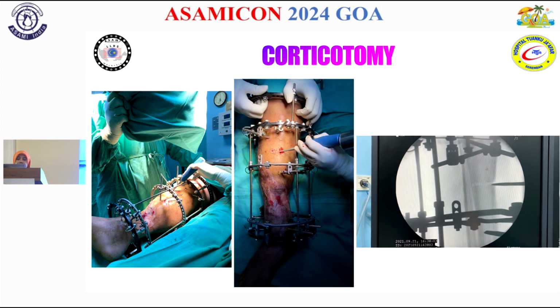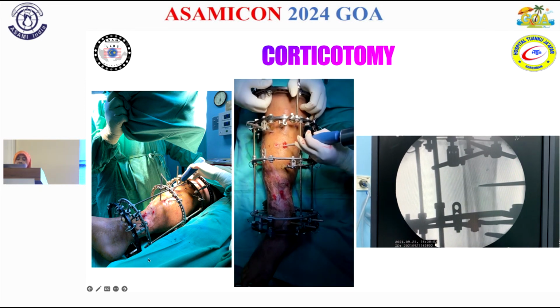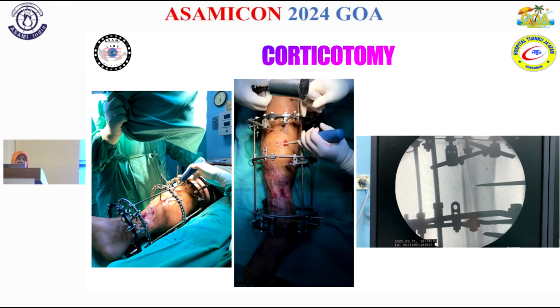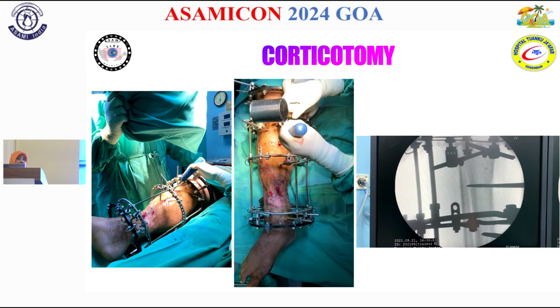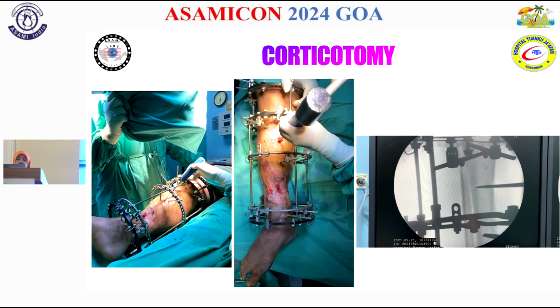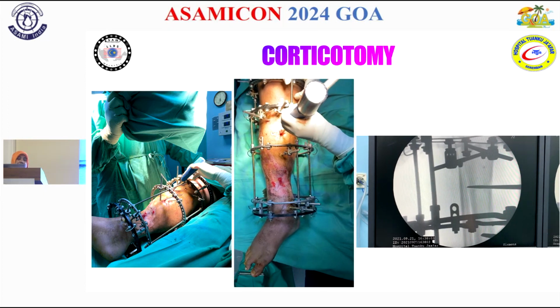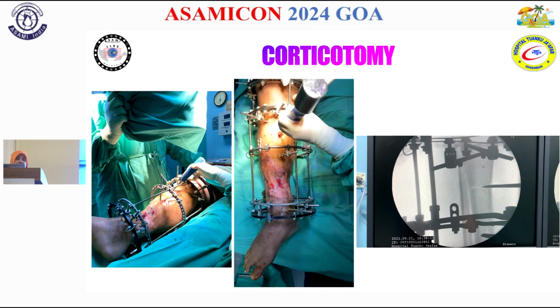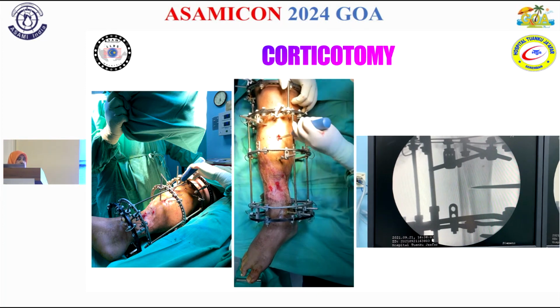Most of the time we need an image intensifier to help us locate where the procedure is, so that we can minimize the time and the patient can have better pain control. Most importantly, we can communicate with the patient, asking whether they have any pain, and at the same time ask them to move the leg and also the toes.